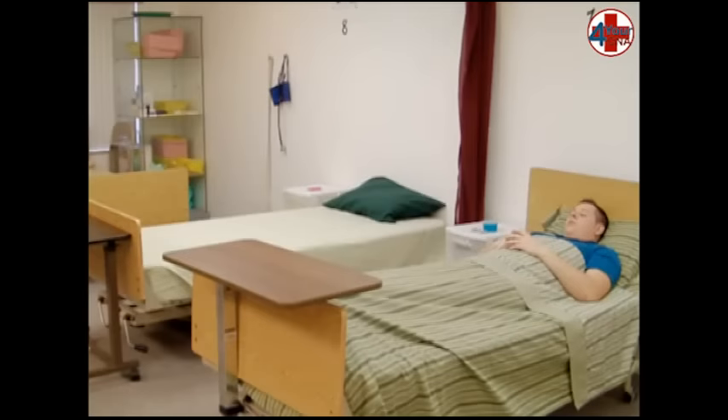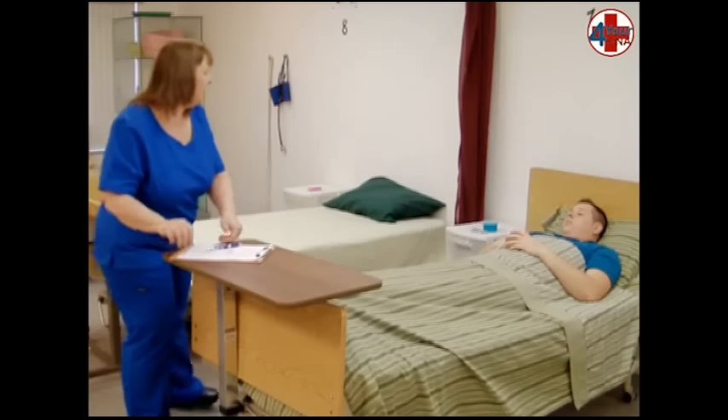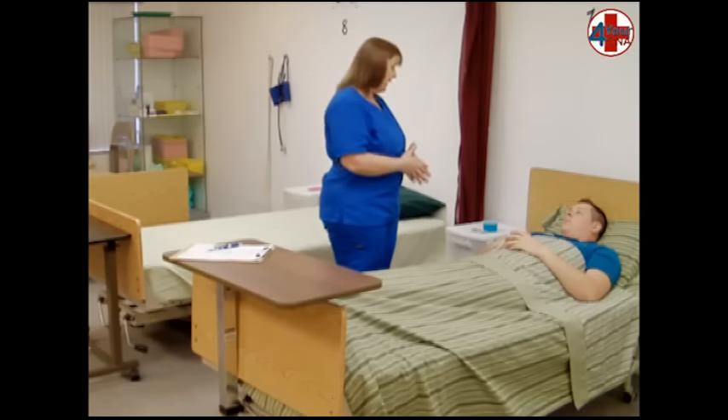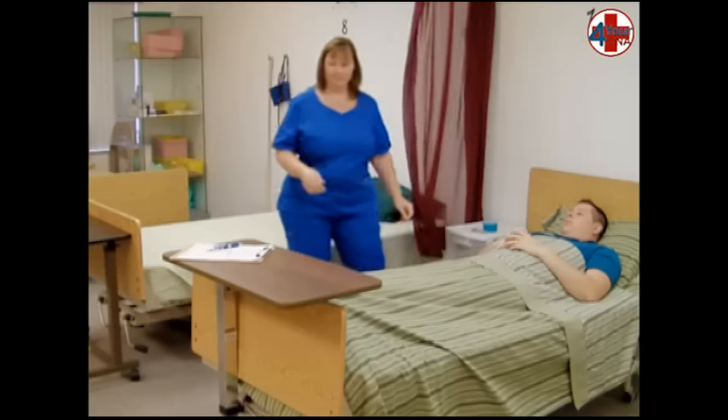This skill will begin with the opening. Knock and identify your patient, place your documentation sheet on the bedside table, introduce yourself by name and title, describe what you will be doing, obtain permission, close the curtain, and wash your hands.